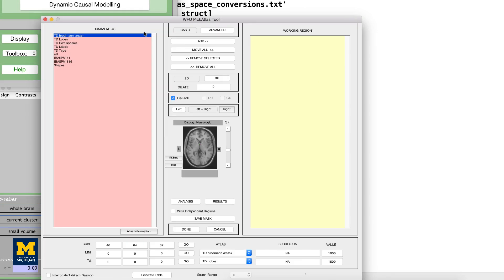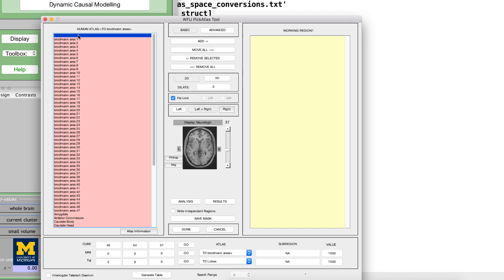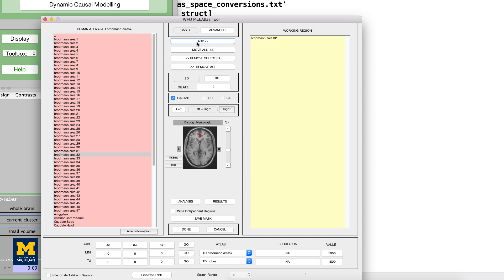Click on the region, Brodmann area 32, in the left menu, and then click Add in the middle panel near the top of the screen. The middle panel highlights in red the voxels that belong to the mask you created, which you can examine by scrolling through the slices.